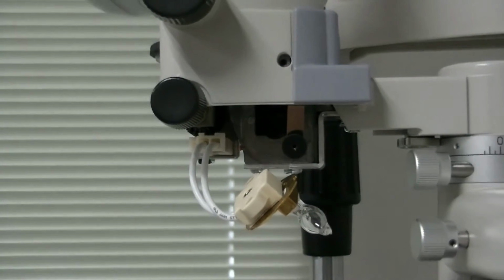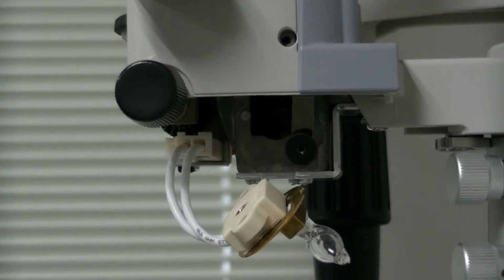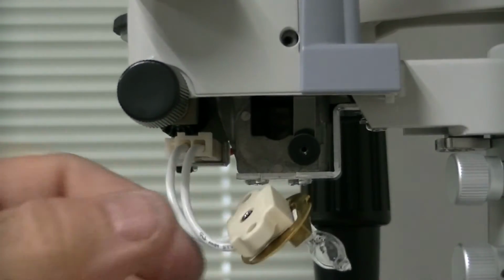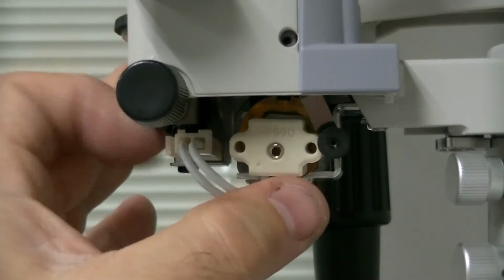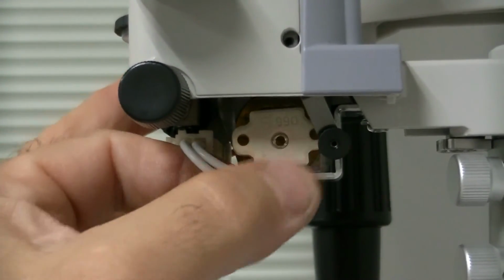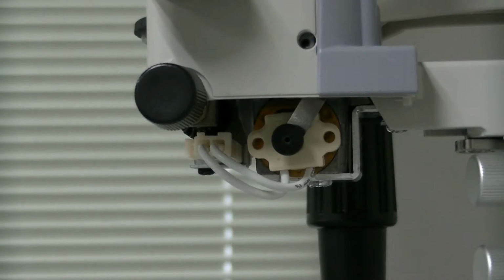You can see the hole in there. And what you have to do, you have to take that keyway that I showed you, that little slot notch, and you have to put it up in here and you'll never see it because it's way up underneath, but you'll see a little tab up there that notch goes into. Once it's in place, pull back on this silver tab and let it come back to the middle of the lamp socket, and that's what holds it all in place, like that.